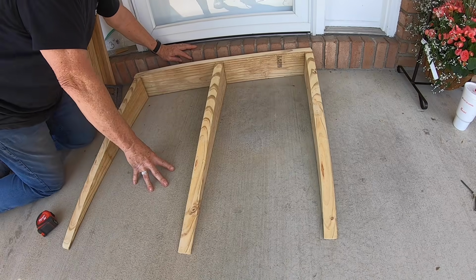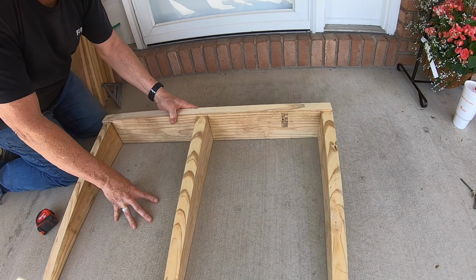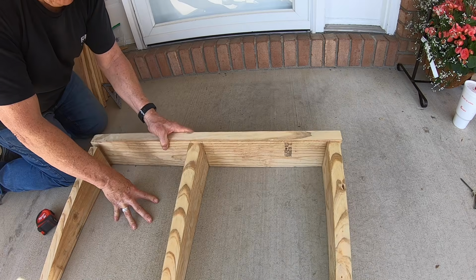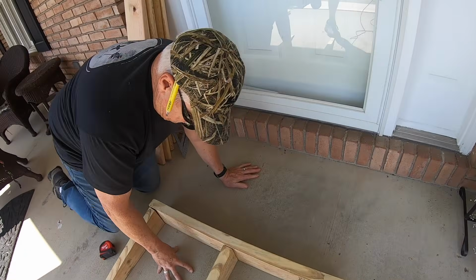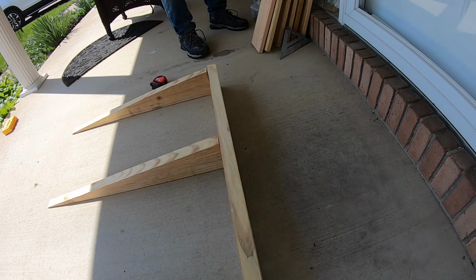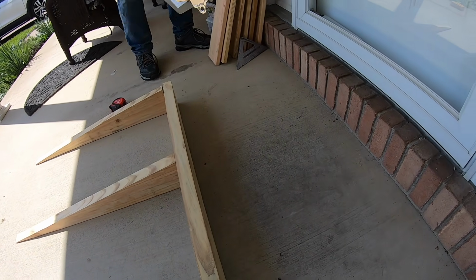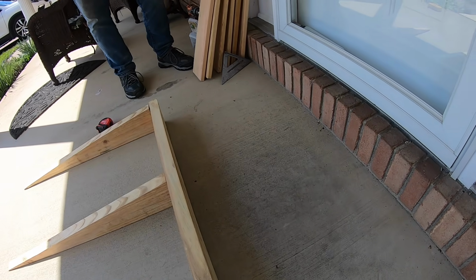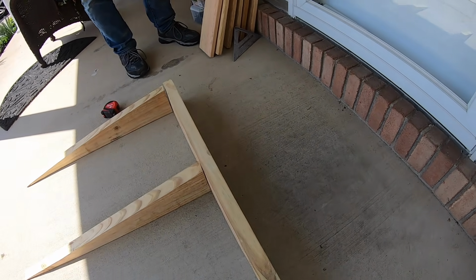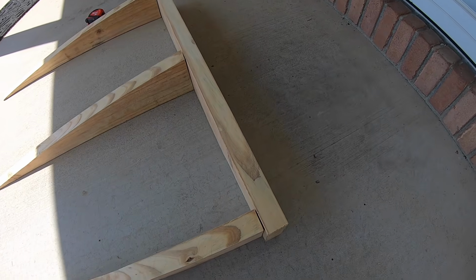So the next step is to go ahead and actually pull everything back out. Nothing is screwed into each other yet. And this will allow us to get the proper screw in from the back side. And so we will also pre-drill to make sure we are exactly where we want to be on each one of those. There'll be 2 screws, 2 screws, 2 screws for a total of 6. And these screws should all be 3 inches long. That way they can really get in there and grip really well.